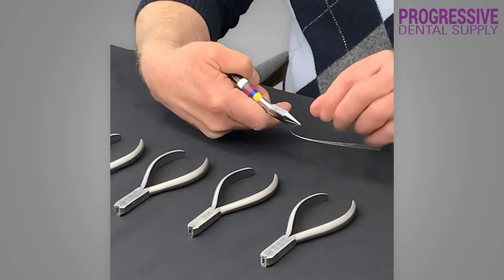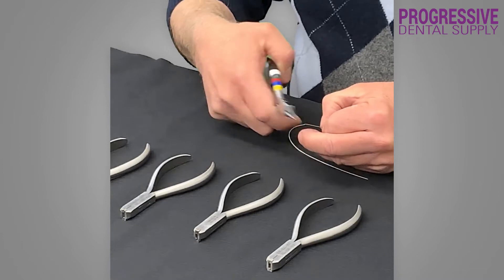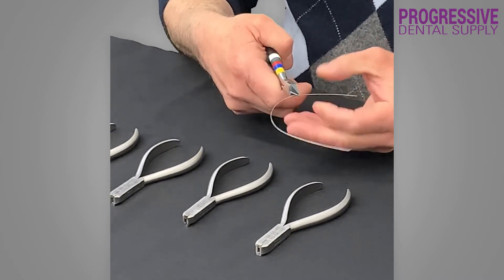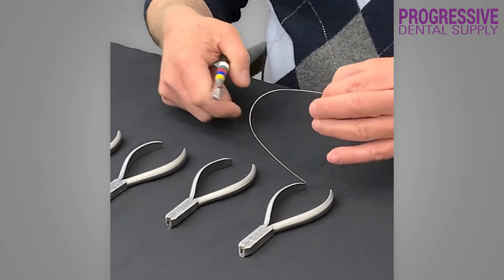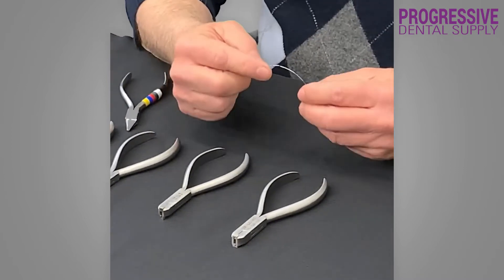Then I start making my bends. I make sure that my bend is correct, that I'm not at a different plane. Then I bring the wire towards the other mark, make sure that my wire is in the right plane, and then finish with my bend. And here we have that second order bend.